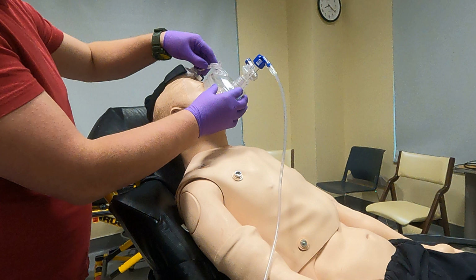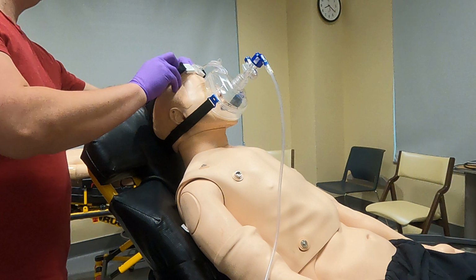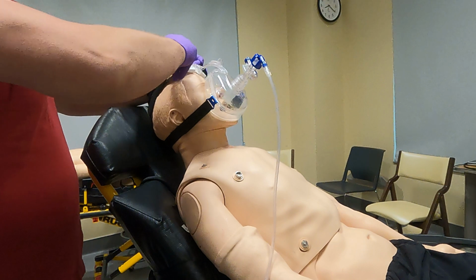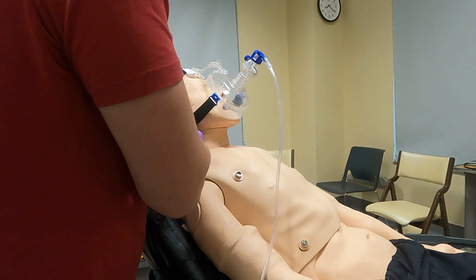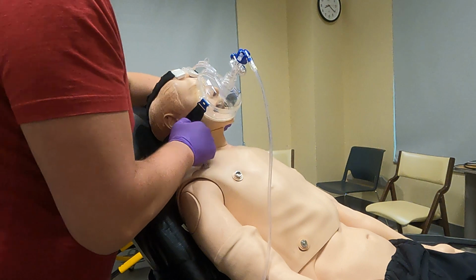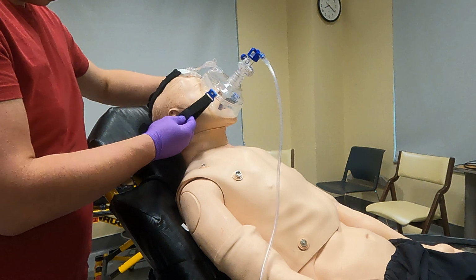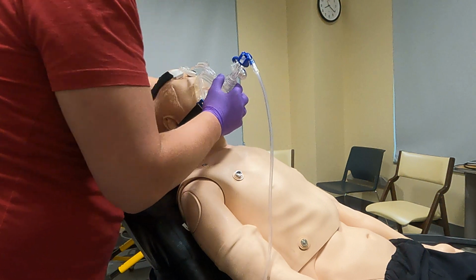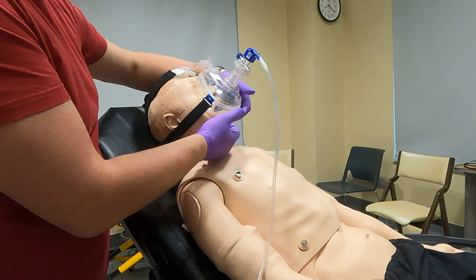I'm going to adjust the forehead piece so that it's snug against their forehead. And now we're just going to tighten this device down so that it's snug. You don't need to refit all the way down on their head. Just adjust both sides at the same time. Make it snug there. Same thing down here at the bottom part. Whoops. Try not to do that. And just make sure that it's nice and snug. Why are you not Velcroing? There we go.